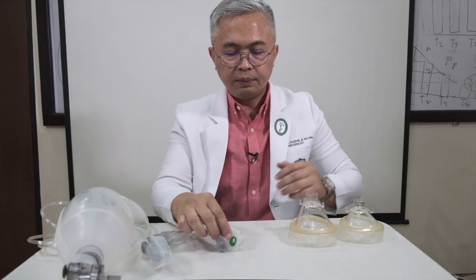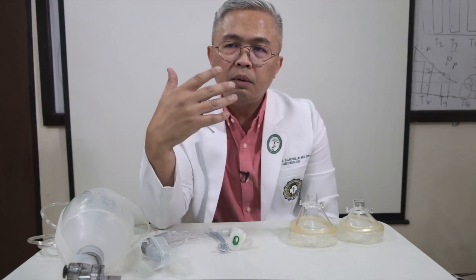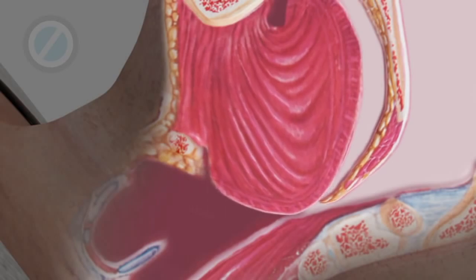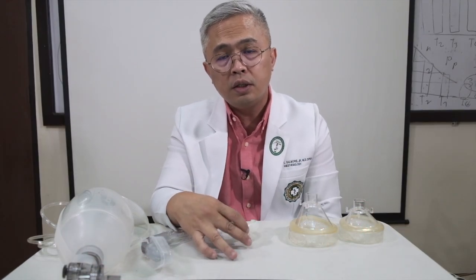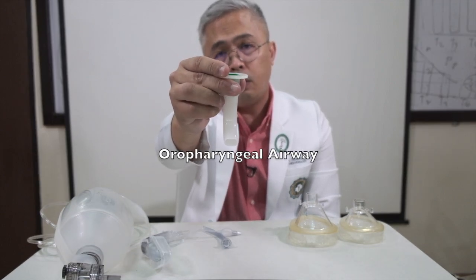Okay, so that's one. So when we put patients to sleep, we give induction agents. Muscles in the airway relax, and sometimes the tongue falls back and obstructs the airway. That becomes very difficult to ventilate patients. So we use what we call adjuncts. I've got here two. This is an oropharyngeal airway.